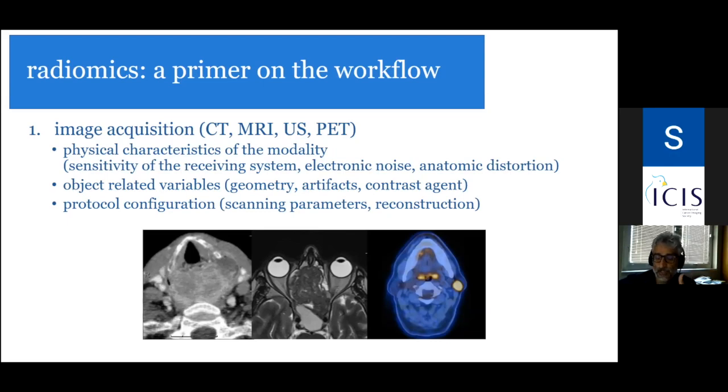Why this? There are a number of reasons. So to try to understand these reasons, probably the first essential step is to try to understand what is radiomics and what is the pipeline behind the path that leads from acquiring imaging to obtain big data about these images.